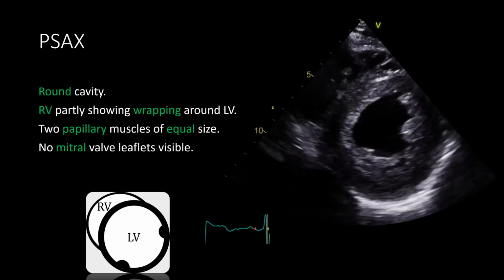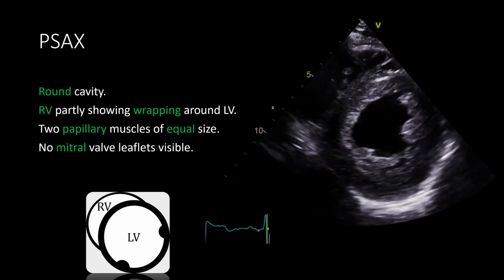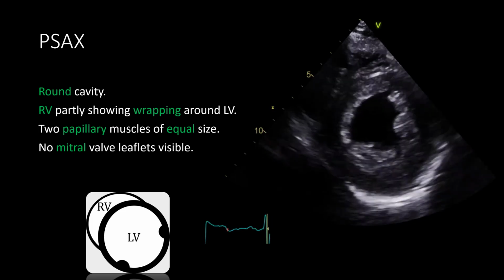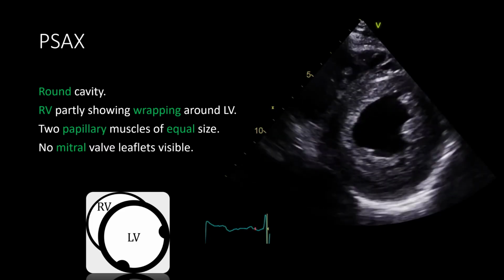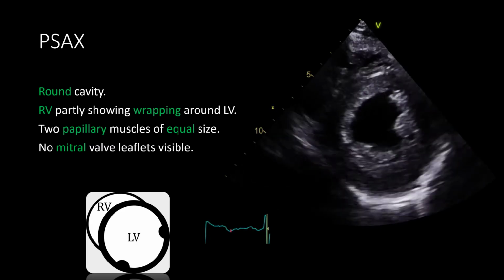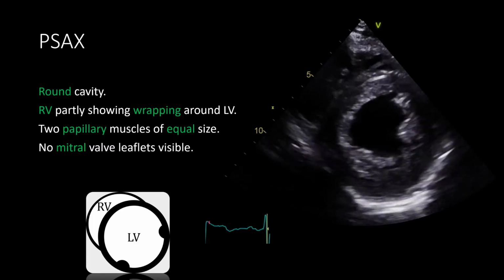The parasternal short axis view is a useful view for gross LV systolic function, with the caveat that it only covers the mid portion of the LV. It is the most useful view for interventricular pressure differential assessment, also known as interventricular septal assessment. One will often be able to pick out posterior pericardial effusions, something particularly useful in post-op cardiac surgery patients that can have loculated effusions. Standardizing this view requires making the cavity as round as possible.